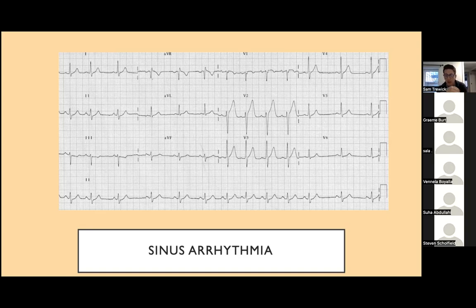So that would be an unconcerning ECG to see, providing that you accept that there's no concerning ST elevation there, from the irregularity point of view. But well done, that was really good.